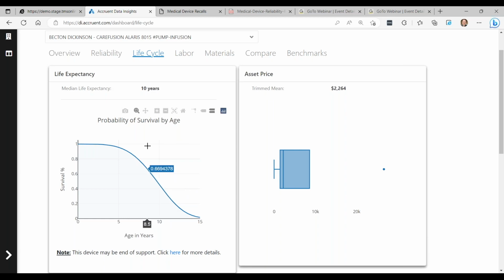Well, I can look at this right here and say, all right, at 8 years, 73% of them are still active out of all of what we've seen from all that data. Well, in 2 years, that's going to go down to 45%. So about almost half of what's currently active will no longer be active. So it gives you better decisions when it comes to equipment replacement, on can this survive going another 2 years.